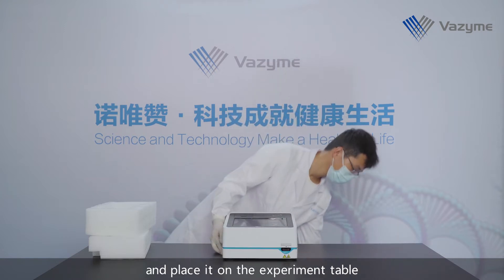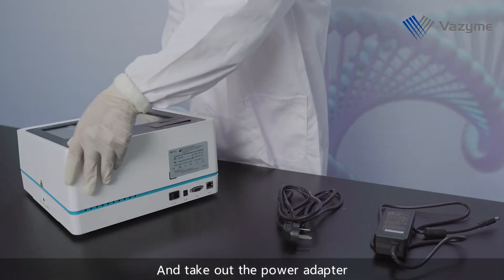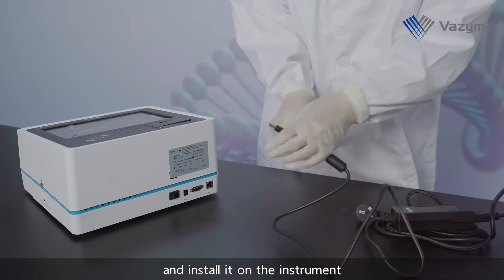Please take out the instrument and place it on the experiment table. Take out the power adapter, connect the power cable, and install it on the instrument.